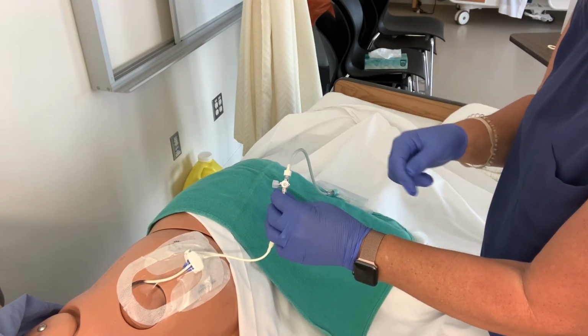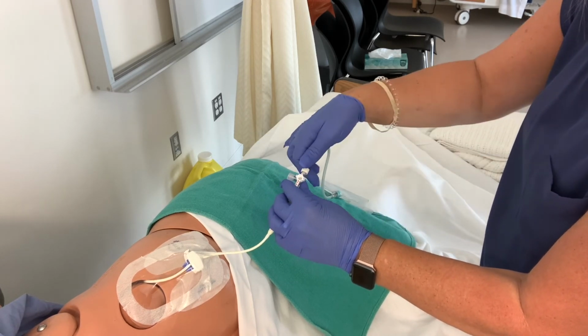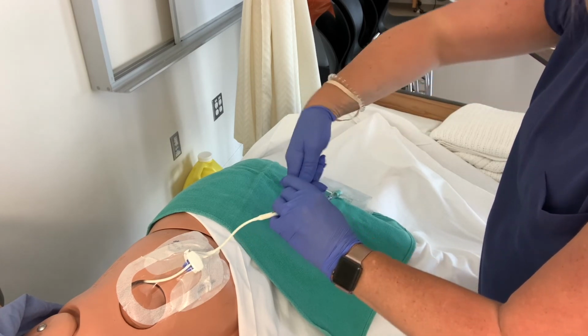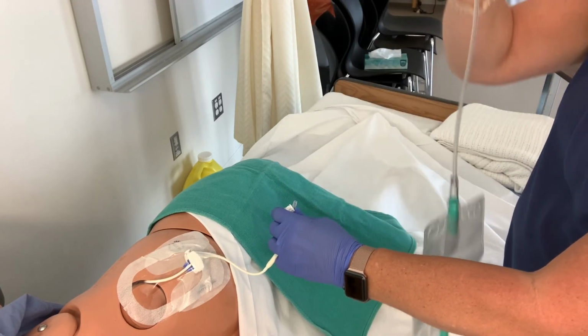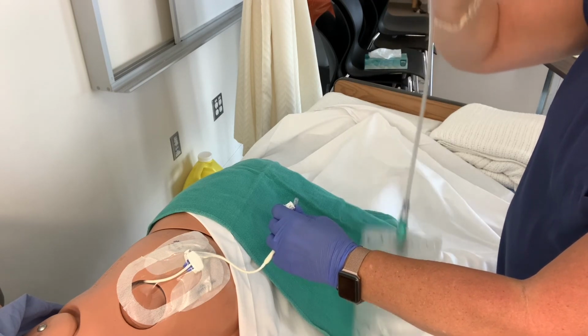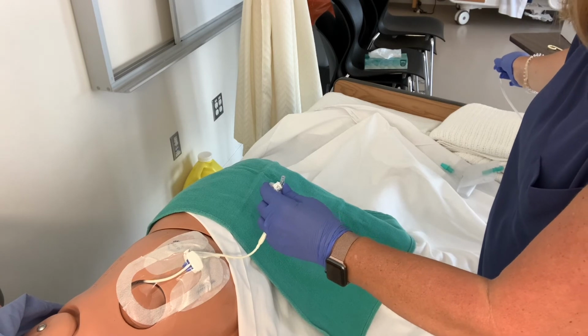When that dries, I need to ensure that I'm turned off to the patient. I can then leave the stat lock on. I'm going to remove this bag and connector tubing, okay? See this? This part's all garbage, so I would throw this away. That has to go in biohazard because it's bodily fluids.